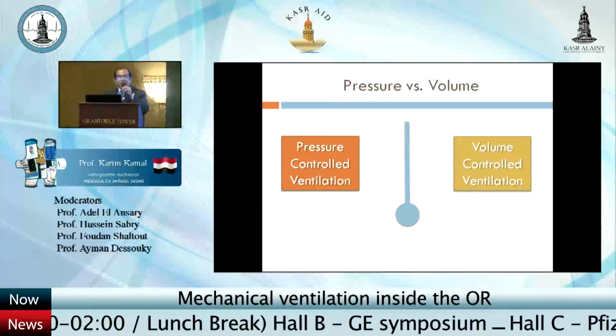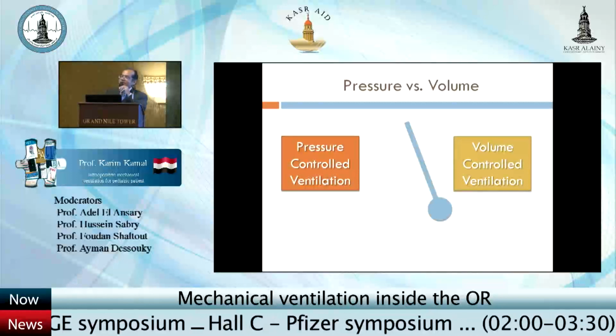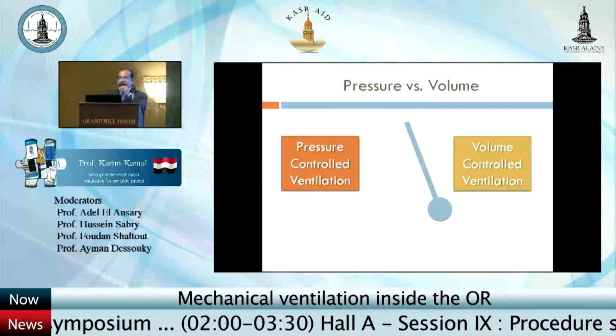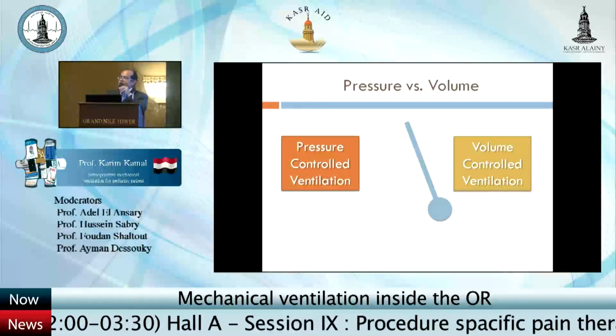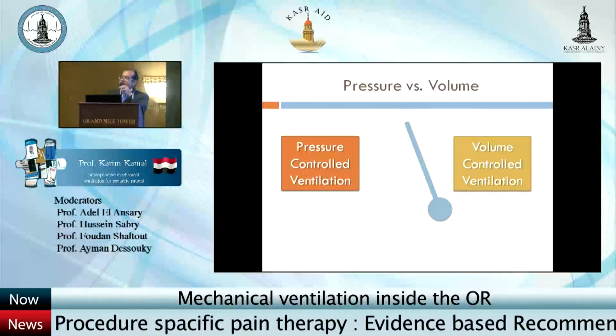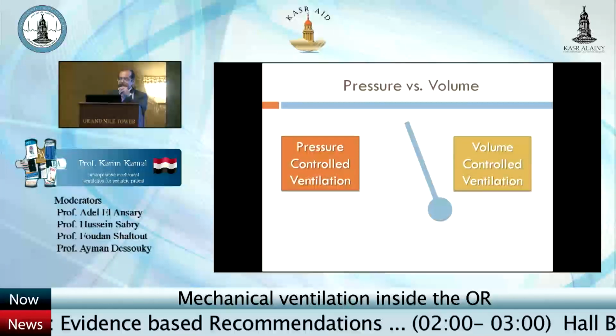So that led to the pendulum moving dramatically towards volume controlled ventilation. Everybody decided, okay, I'll use volume controlled ventilation. This will give me better oxygenation for the lungs. But after a while, people started to understand that there is a problem with volume controlled ventilation.